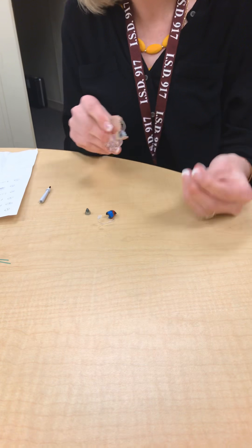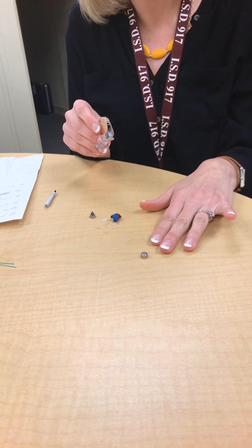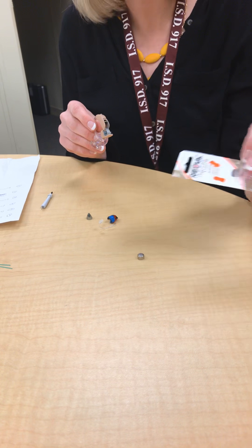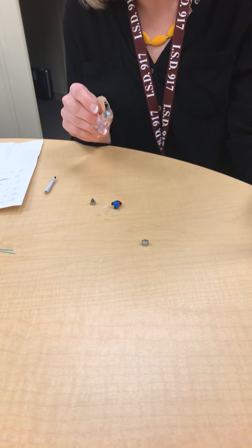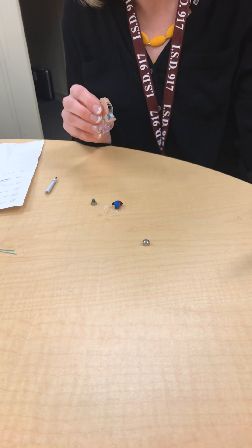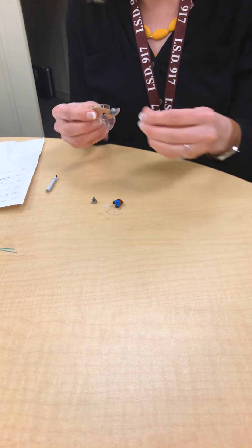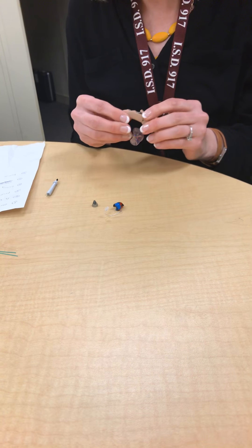If I have a hearing aid that's not working, the first thing that makes sense to check is the battery. Take the battery out and drop it on the table. If the battery stays there, you have a good battery. If the battery bounces, you have a bad battery. Sometimes you just get a bad pack right out of the gate, so even though it doesn't make sense, you may just have a bad battery. If the battery bounces, go ahead and change it and hopefully that will take care of your problem.